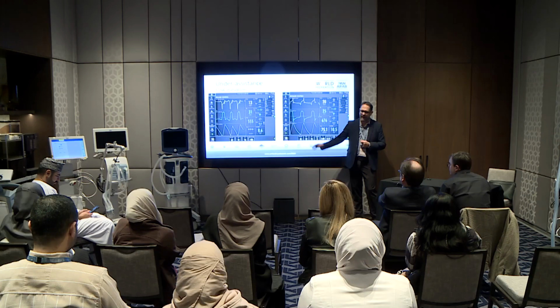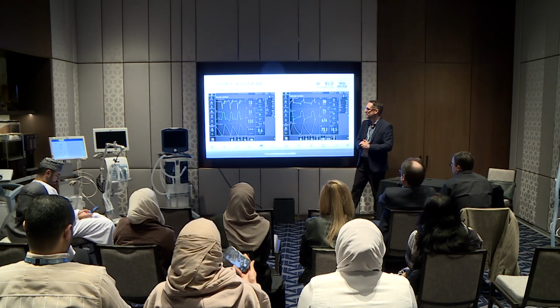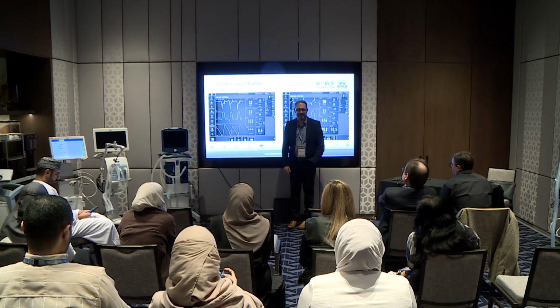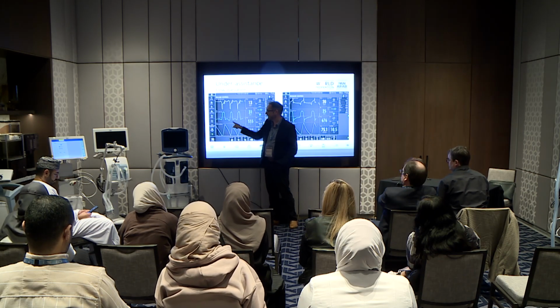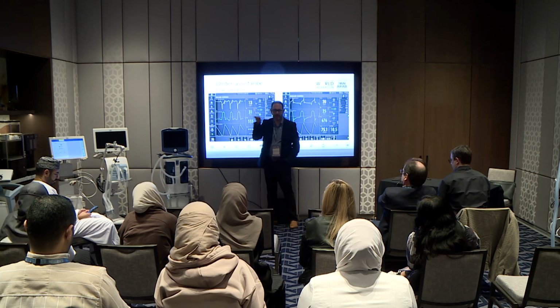Okay. So I'm going to show you some pictures, and then I'm going to quiz you on these pictures afterwards. We're in volume control. This looks crazy to me. Again, if you're always wondering what's going on up here, look at the flow. Because above here is inspiration and that's exhalation. So clearly the patient is breathing in. Now, volume control is supposed to be square, right?